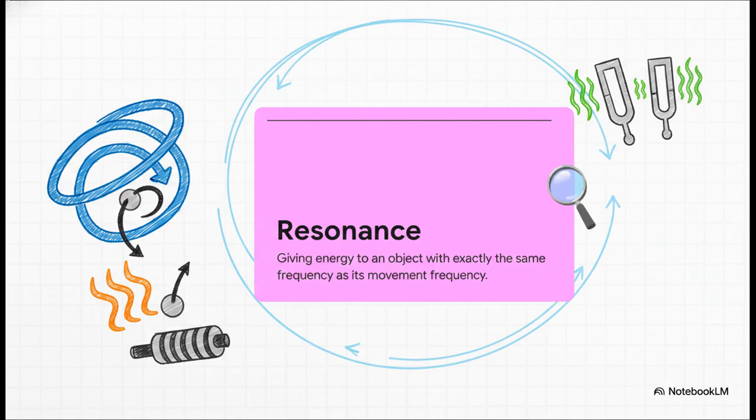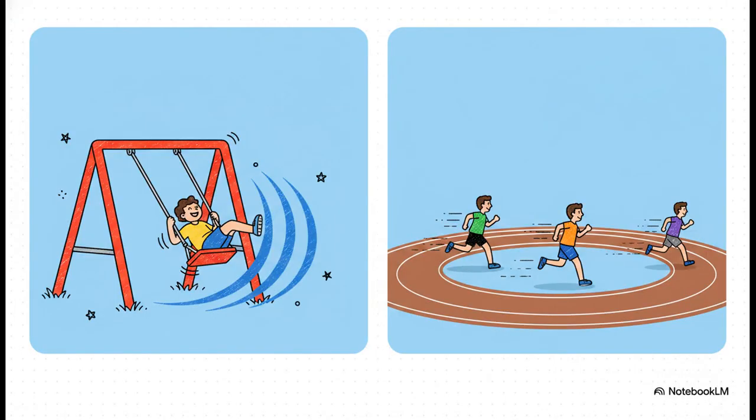But we can't just blast them with random energy. No, we have to use the exact Larmor frequency. Why? Resonance. Resonance is what allows us to highly efficiently transfer energy to the protons. It pushes their magnetization 90 degrees into what we call the transverse plane, which is exactly where our coils can actually measure them.